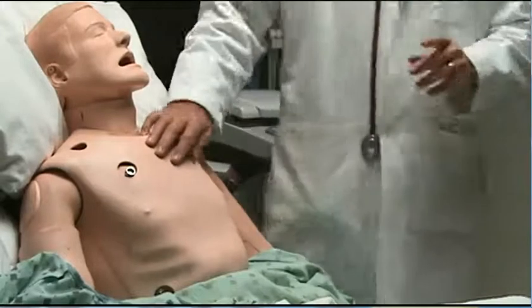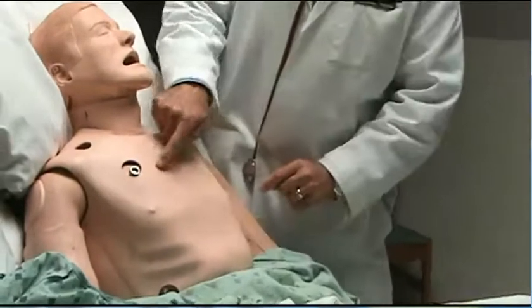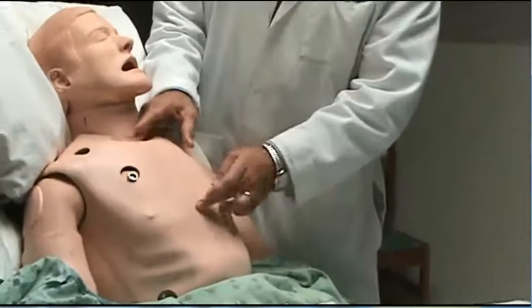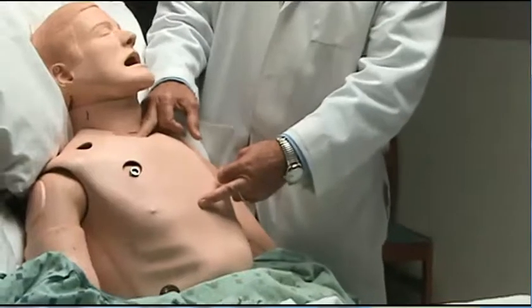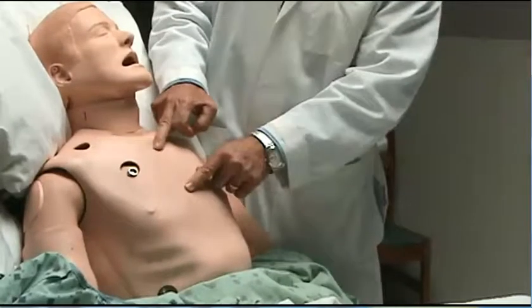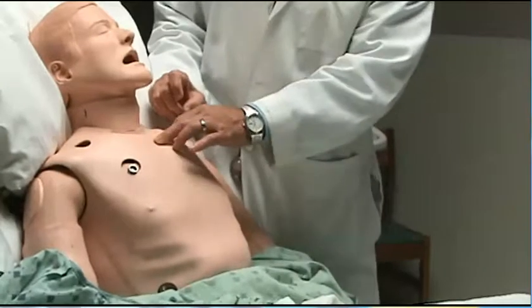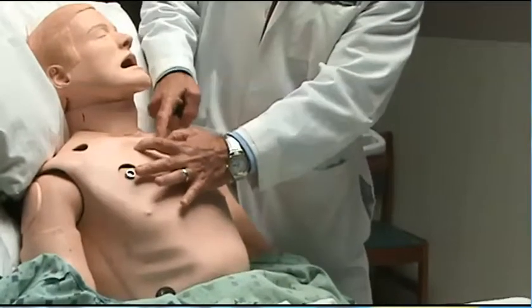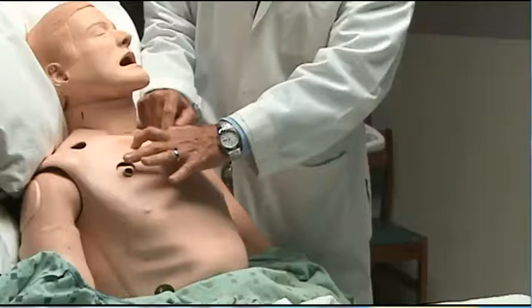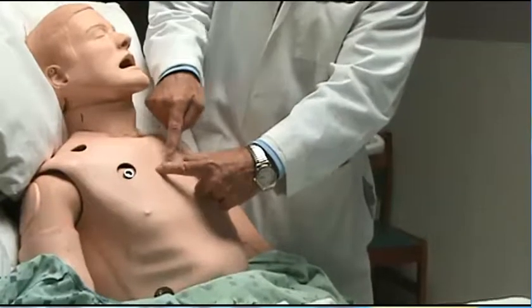The main reasons people put the leads too low are: first, they haven't been checking their landmarks — they just eyeball it and think somewhere in there is about right. You can't do that; you have to check the landmarks in every person. The sternum is comprised of three sections: the xiphoid at the bottom, a larger piece in the middle, and a smaller piece at the top. Between the smaller piece and the big piece in the middle there's a ridge — you can always feel it by running your fingers across it. At the outside edge of that ridge is the second intercostal space, then you count to the third and then the fourth. Right next to the sternum in the fourth intercostal space is where V1 and V2 go.